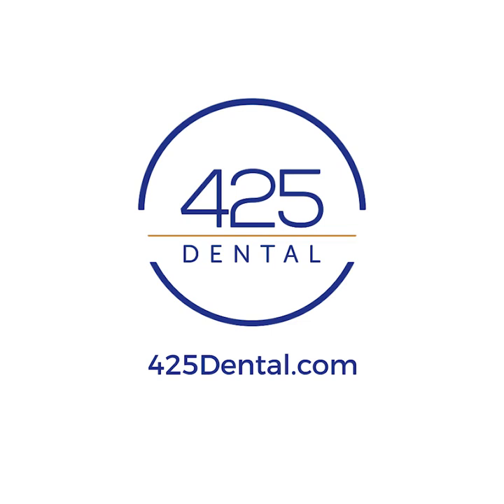The munchie we provide is used at night before bed. After you have eaten dinner and brushed your teeth, it takes 5 minutes to use the munchie, concentrating on the top and bottom front 6 teeth. There are 3 sides to the munchie, and each side is used for specific teeth.